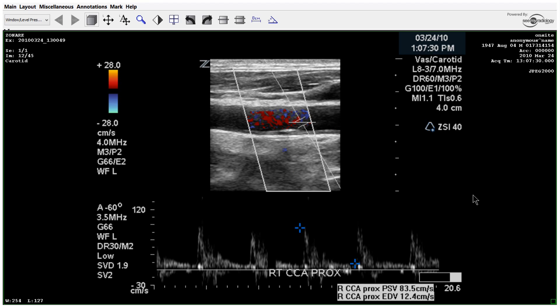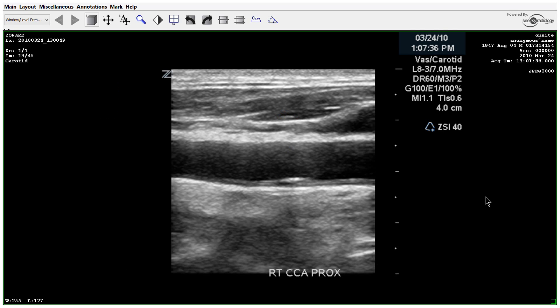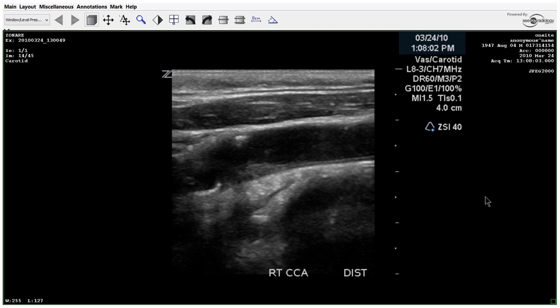Moving back to the proximal common, we're getting our velocities. You can still see some intimal thickening with a little calcification plaque here at the proximal common, and then distal at the bulb.